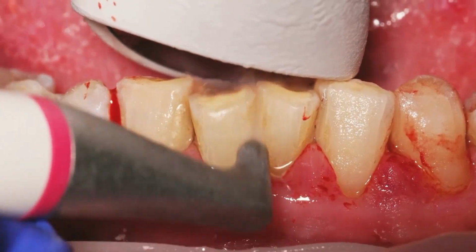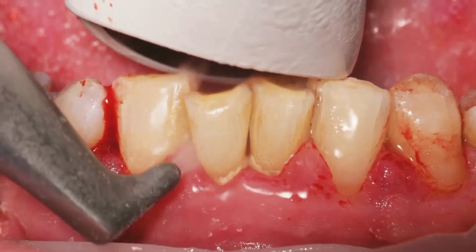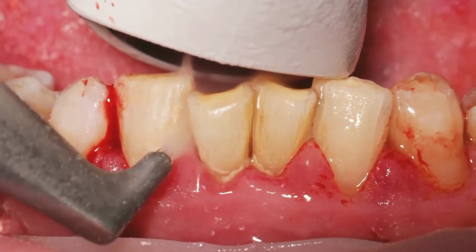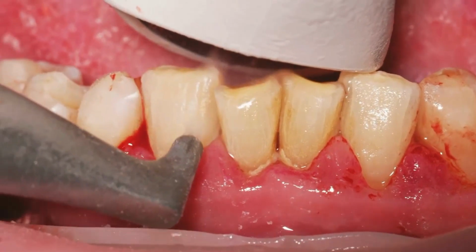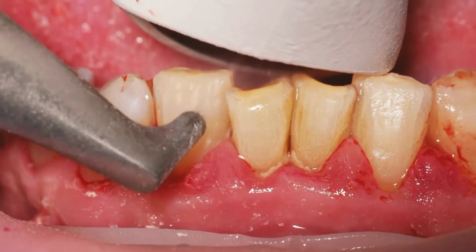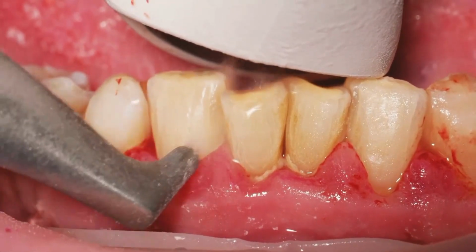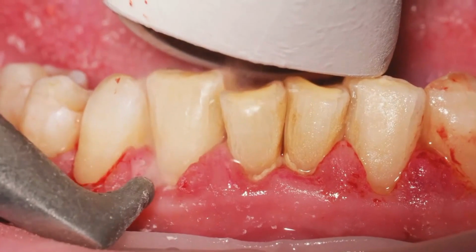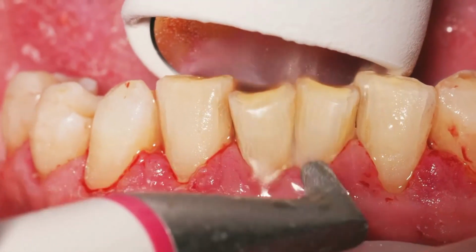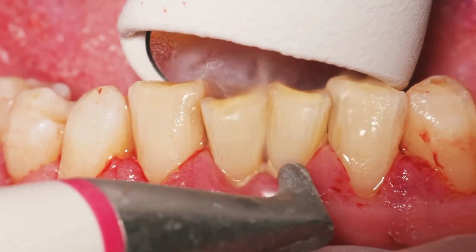And you see that we don't care about the calculus at the beginning. We try to remove the biofilm from the calculus, and only at the end of this part will we remove the supragingival calculus and the subgingival calculus with the PS tip.